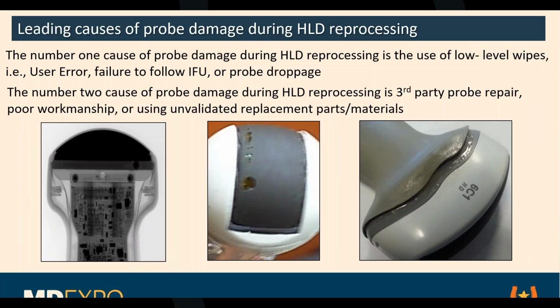Not safe. Anything that has this on the lens, because that's direct patient contact, okay? There's electricity going up to the acoustic stack, and so you've given it both a path for electrical current to flow into the patient, and you've also given a path for the ingress of fluid back into the probe. So that would absolutely not be safe to use on a patient. Plus bugs would be hiding everywhere.